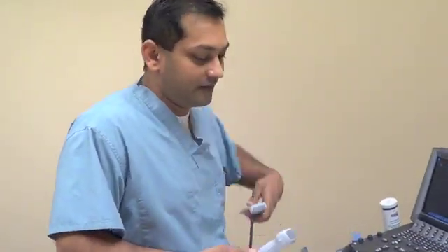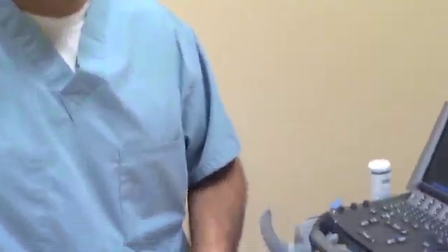My name is Rohit Patel, one of the EDI-CU physicians. Today we're going to talk about the probes you see on a normal ultrasound machine. There are two types of probes: one is usually a flat probe, and one is usually a little bit more square and rounded.